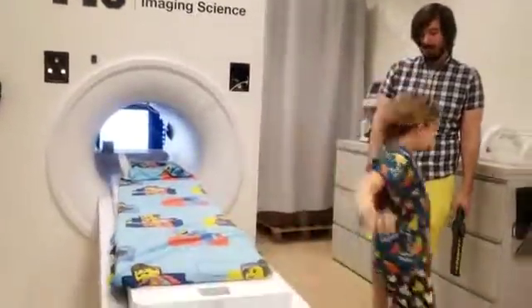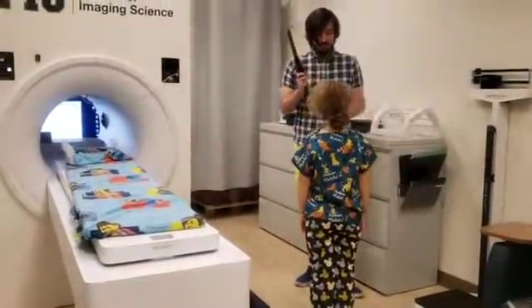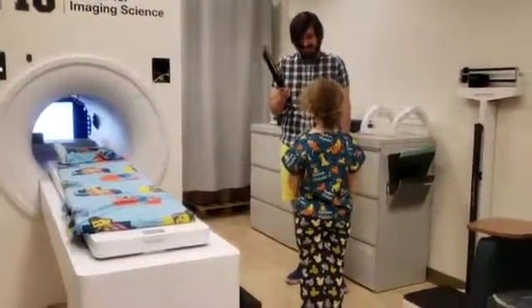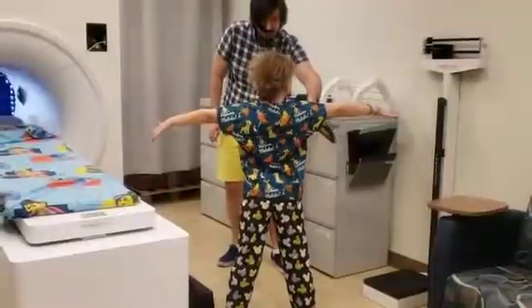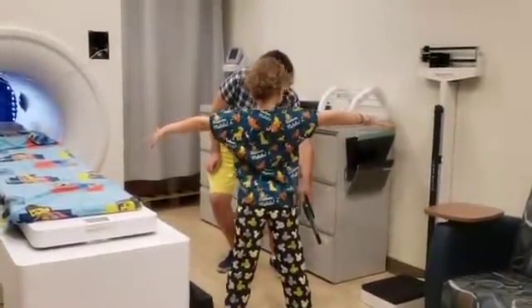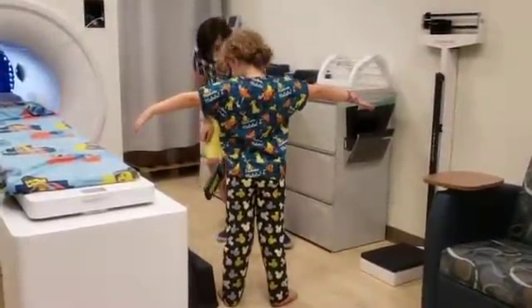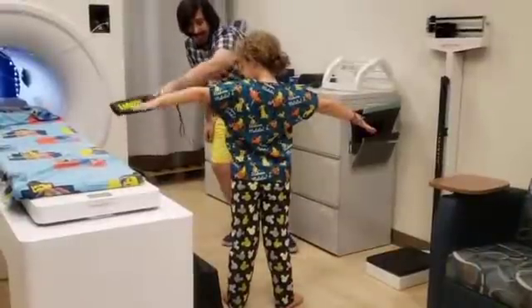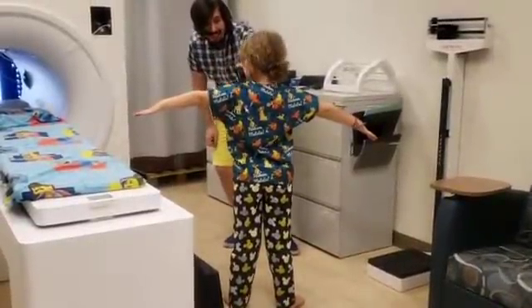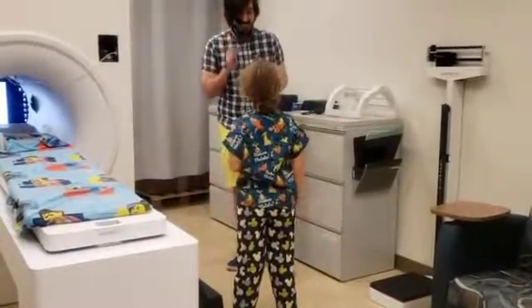Because the brain camera is a very powerful magnet, it's very important that you don't wear anything metallic or shiny to your brain camera visit. This can include more obvious things such as jewelry or piercings, to less obvious things such as certain makeups, glitters, or tinsels in your hair. Then we'll check to see if you swallowed any pennies or if you're a robot. If you aren't sure which things count, feel free to give us a call before your brain camera visit.